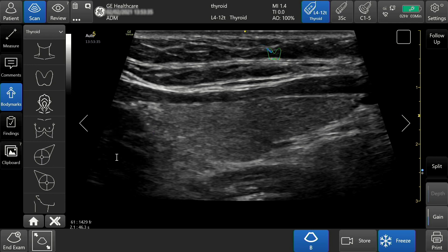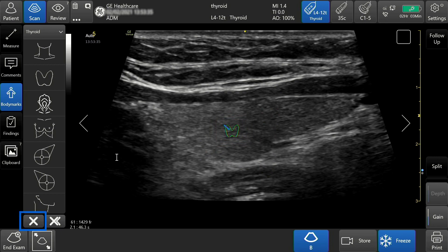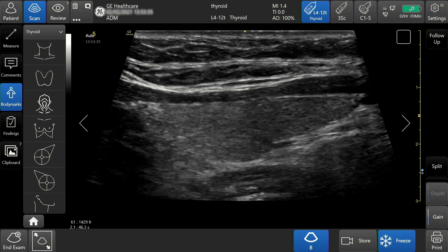A small body mark is then placed on the screen. Should you wish to move it, simply drag the body mark anywhere on the screen. Tap X in the lower left hand corner to remove the body mark from display.